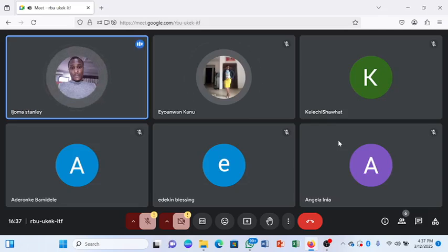They have a second type of specimen. We are now moving into those that require specific instructions. You have the midstream urine specimen collection. What is midstream? I think in your notes on the paper you have there, it said it's a clean voided or a clean catch specimen.